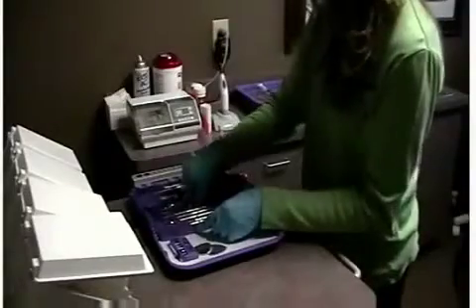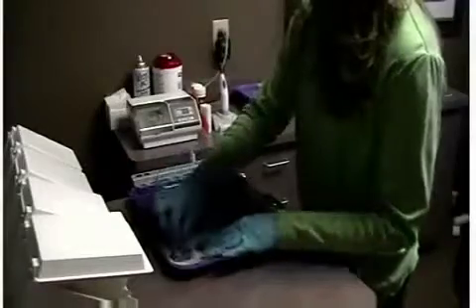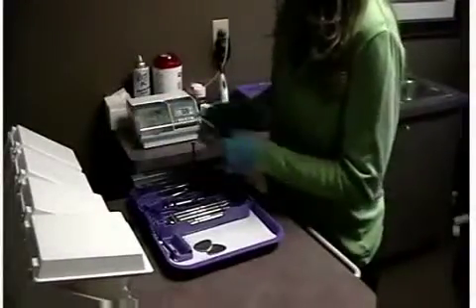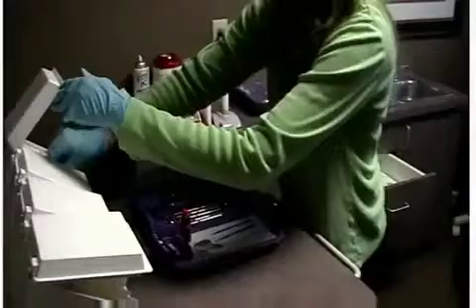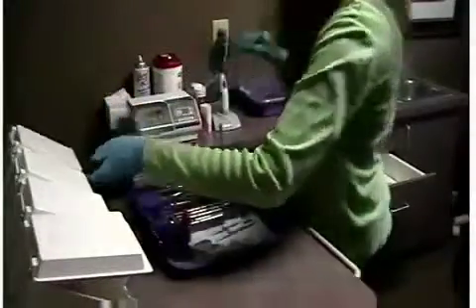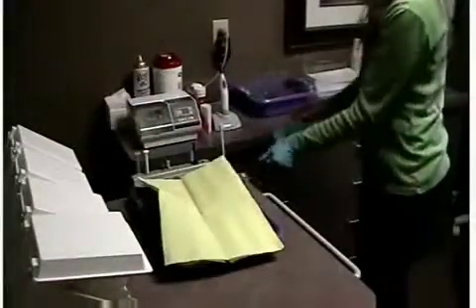Begin setting up your chairside workspace by placing your commonly used items from the operatory drawers and your other items from the tub onto your tray. You should only pull the materials you will use from the tub. Set the tub cover back on but do not lock it — this will prevent aerosols from settling on your materials, while all materials will still be easily accessible should you need additional items. Now your tray is complete with all instrumentation and supplies. You can recover your tray with a lock-on cover or bib until the patient is in the chair and you are ready for the procedure.